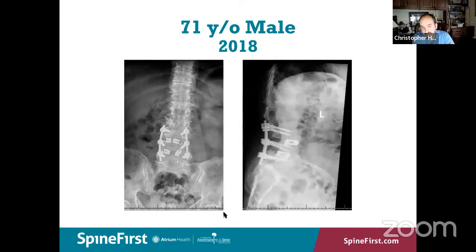Here, the patient was subsequently treated with extension of fusion at L3-L4 and L4-L5, again with bilateral PLIF cages, now titanium cages. His prior instrumentation was removed and he was not re-instrumented across the L5-S1 segment, which at this time was showing solid bone fusion. The patient had this operation, per report still had chronic pain issues, had possibly some short-term modest or moderate incomplete improvement.